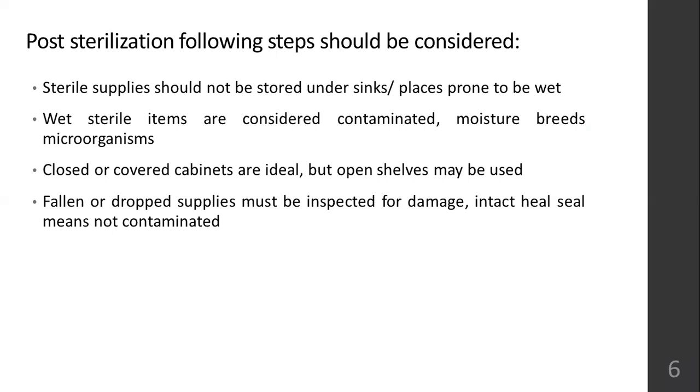Sterile supplies should not be kept, at any cost, under the sink or any places where there is moisture. In these areas you should not store your sterile supplies. Closed and covered cabinets are ideal for it. Open shelves can be used, but it should be a dry area. Fallen or dropped supplies must be inspected properly for damage.